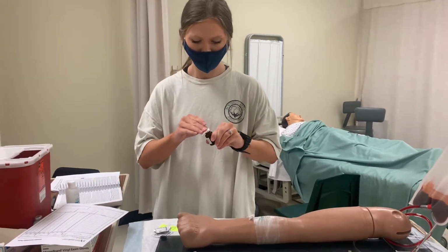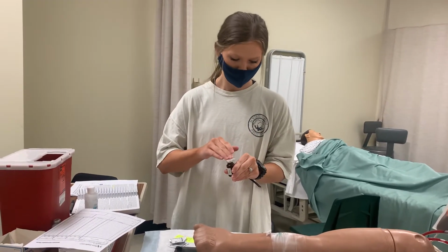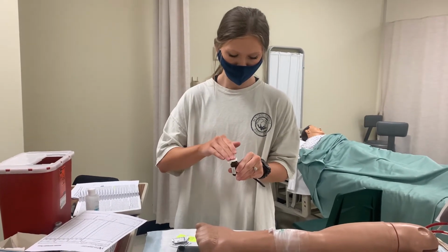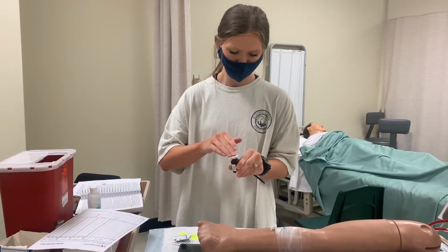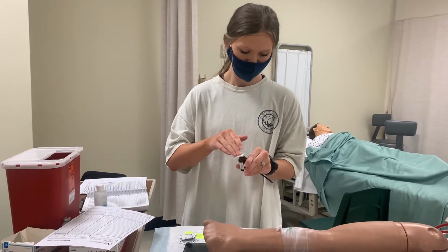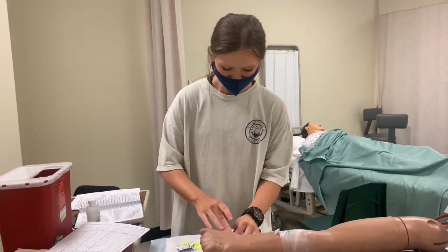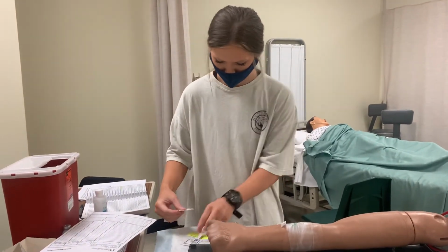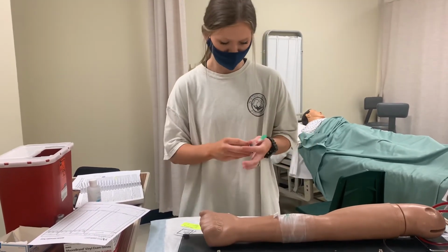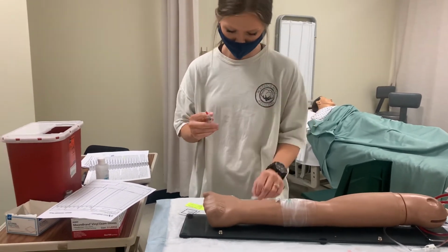I'm getting ready to prepare my medication. I'm going to wash my hands. Okay, grab my bottle and clean it. I'm going to clean it for 30 seconds and let it dry 30. Okay, so that was 30 seconds. Go ahead and throw that away. While that's drying, I have my 2 milliliters of air, and I'm going to get ready to inject that in here.